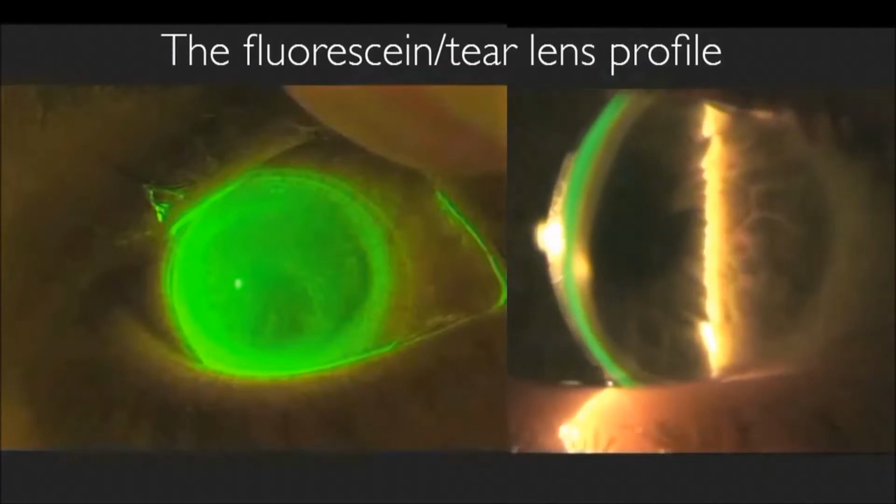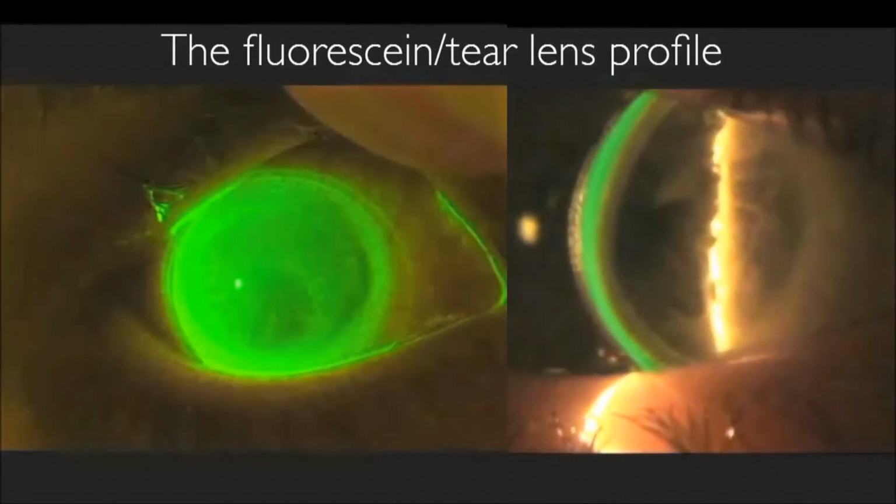So that's how I go about choosing where I'm going to start, what is the sagittal height of the lens that I'm going to use. I look at the eye, I look at the cornea and the sclera, looking at the corneal depth and the scleral shape. So let's look at evaluating the fluorescein pattern.